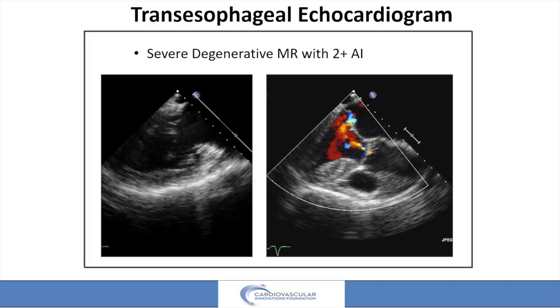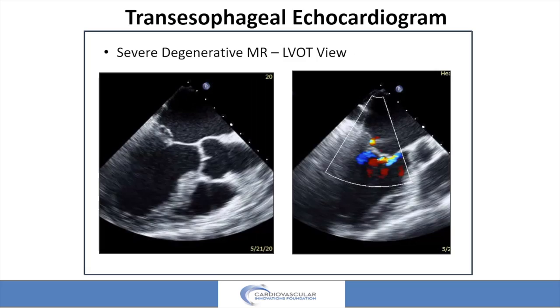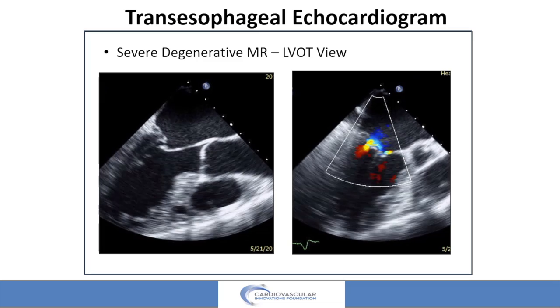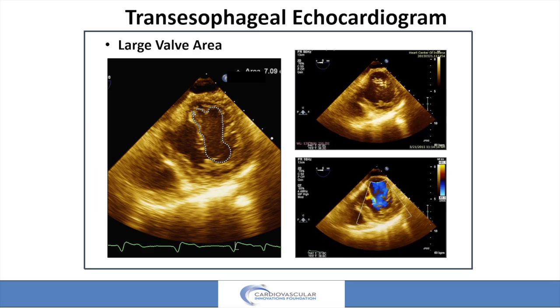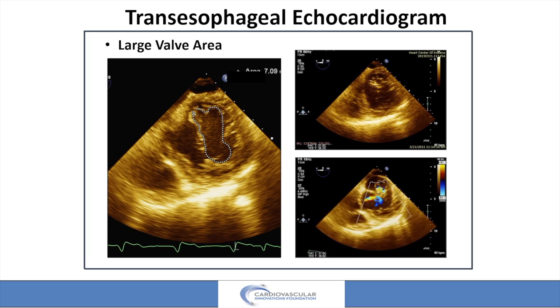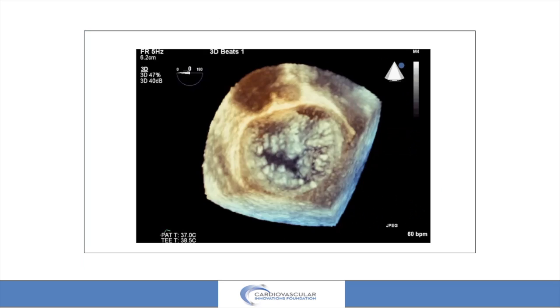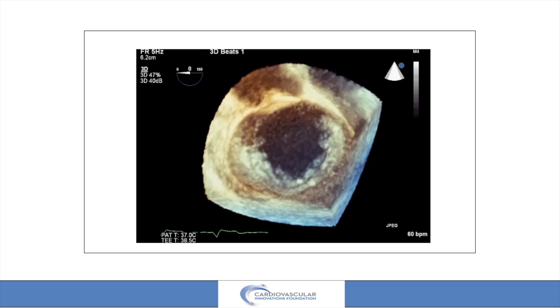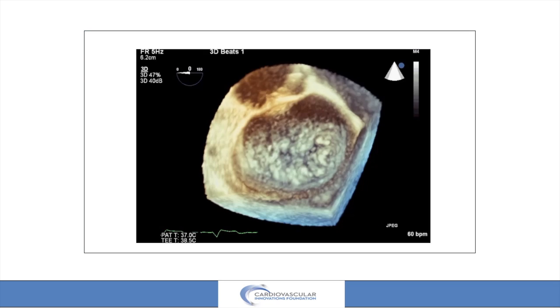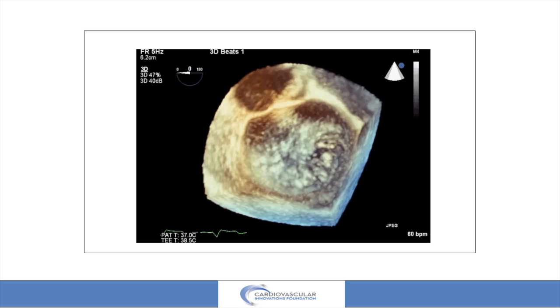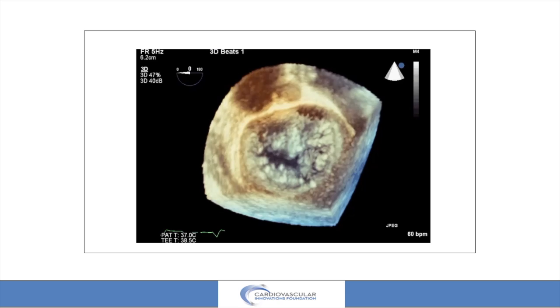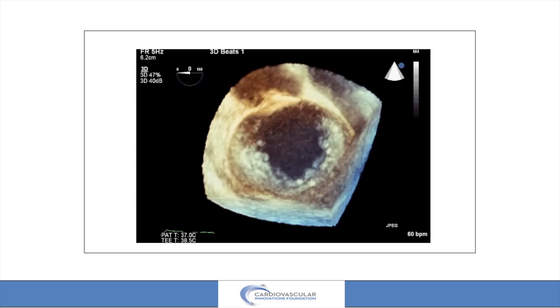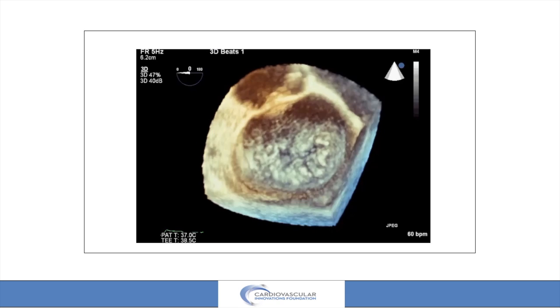This is just the transesophageal view. Here's the long axis view. Fortunately, he's got lots of valve area, which is great — a big valve area, six to seven centimeters squared. And you can see here in the 3D en face view, he's got disease really out into P3A3, as well as the medial aspect of A2P2 — kind of half of A2P2.